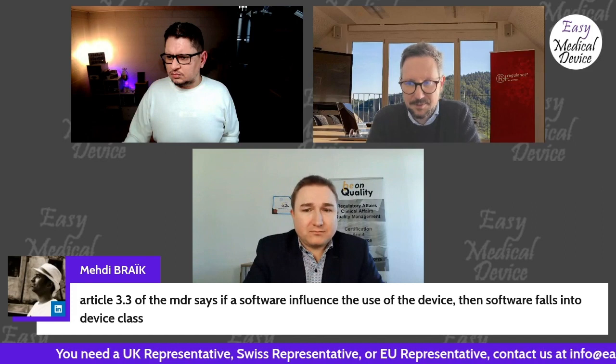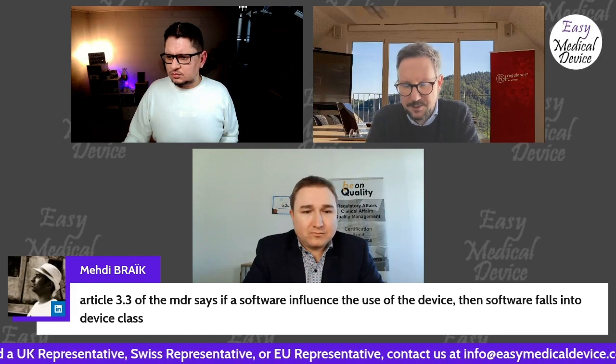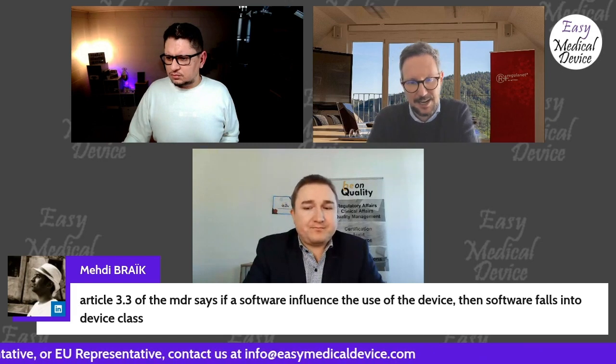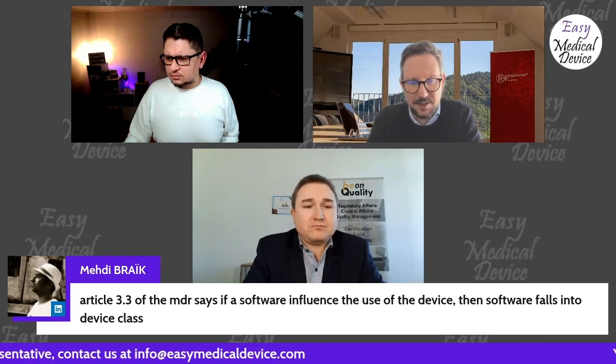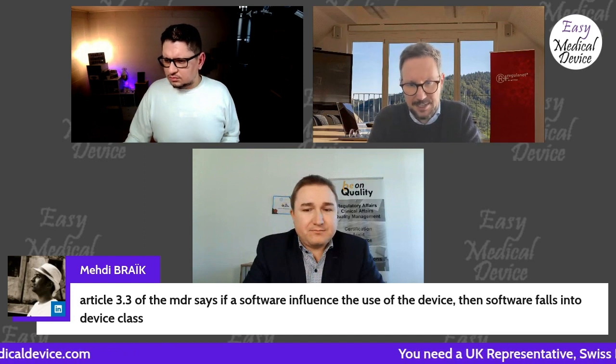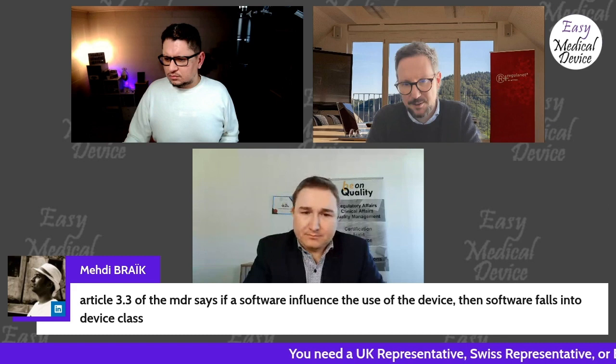But you can connect it to other devices, and it doesn't necessarily mean that you get the same classification. It depends whether you really have an influence on the intended purpose of the other device. If it's just a connection, for example, you read out of this other device and nothing else, that's not an influencing of the other device.